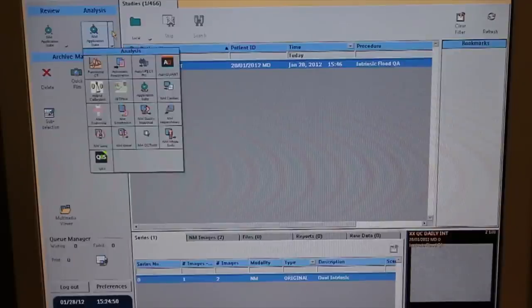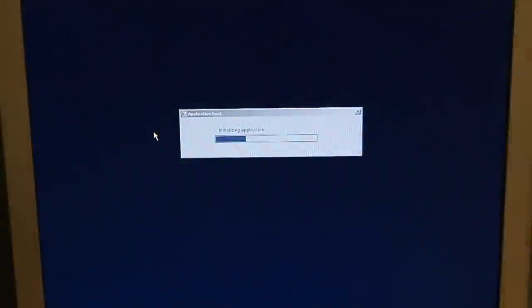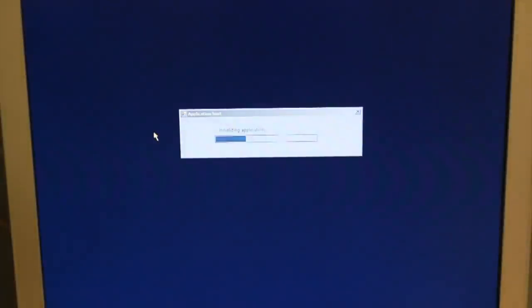Analysis for the extrinsic flood is done similarly to the intrinsic flood. From the analysis menu, initiate the QC tools application.